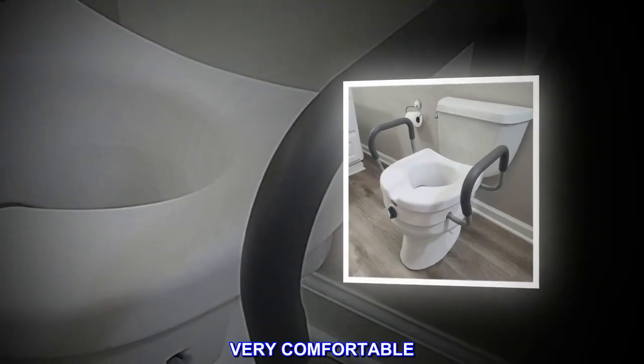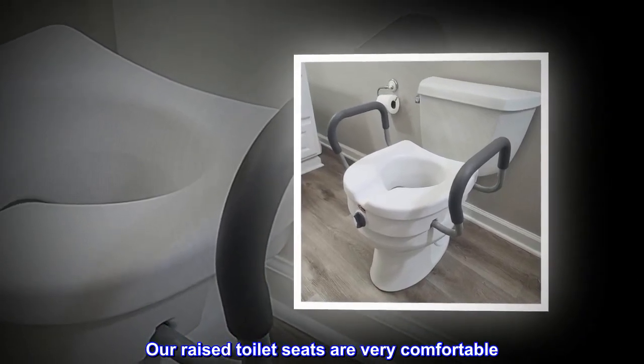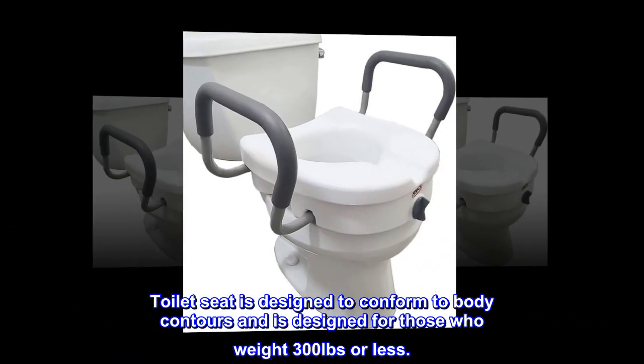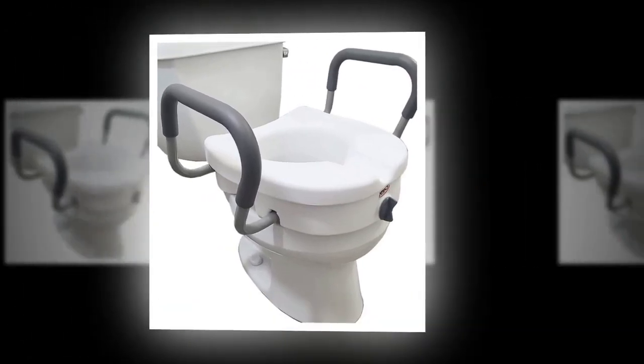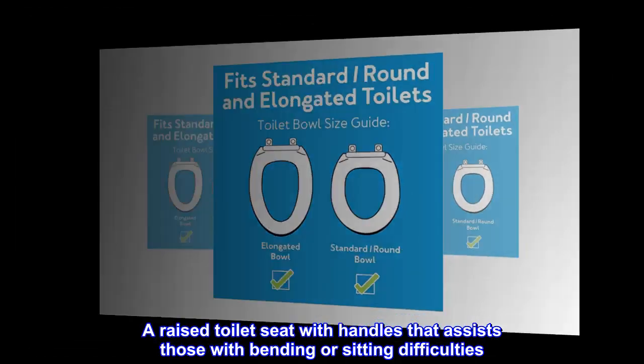Very comfortable. Our raised toilet seats are very comfortable. The toilet seat is designed to conform to body contours and is designed for those who weigh 300 pounds or less. A raised toilet seat with handles that assists those with bending or sitting difficulties.